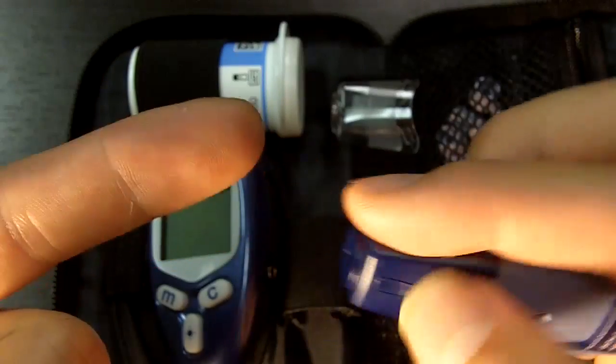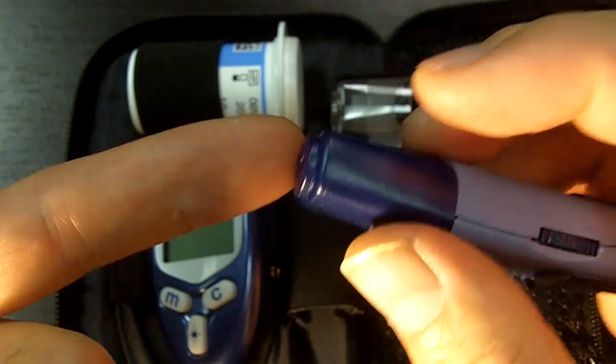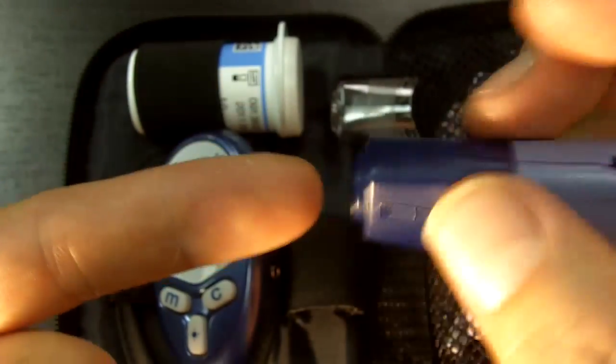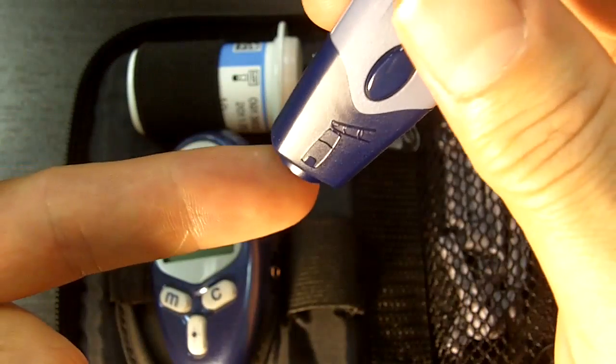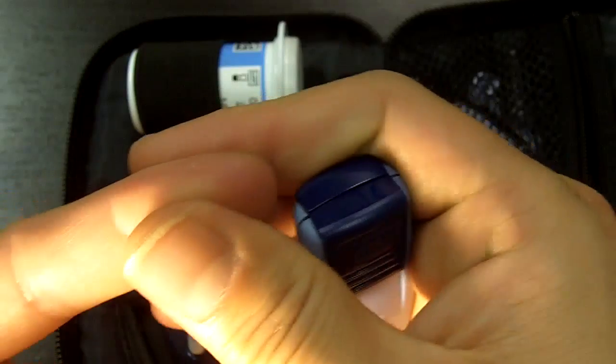Although I've had some patients say the sides are really painful and the middle is actually better. I think it's just individual — some people just have more nerves on the side or feel that the side is more sensitive. So I say test around and see where you are. It's real simple: you just go there, hit the button, and then you squeeze.